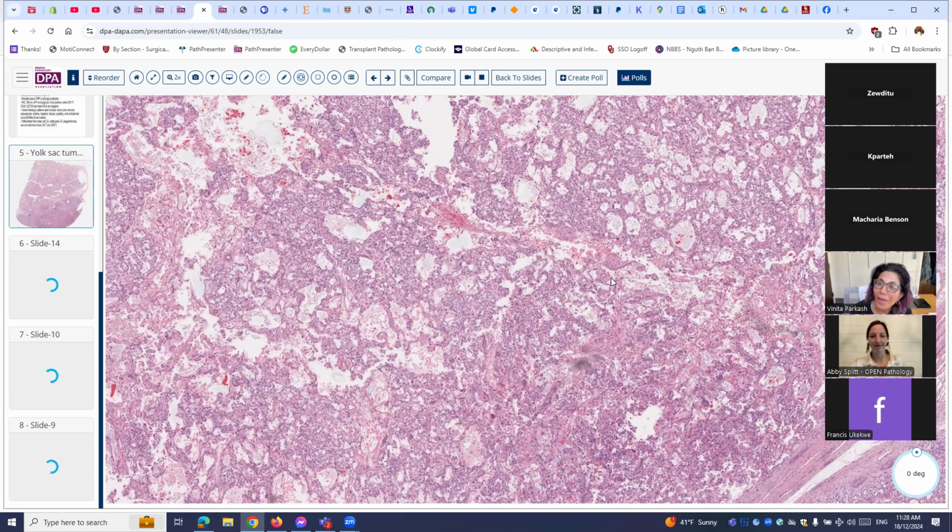No, I was just curious what workup you would do, if any, on these tumors. We have kind of a standard list of what we do on serous carcinoma, but in germ cell tumors, I think it's less strictly defined as to what you absolutely need to do to make a diagnosis.